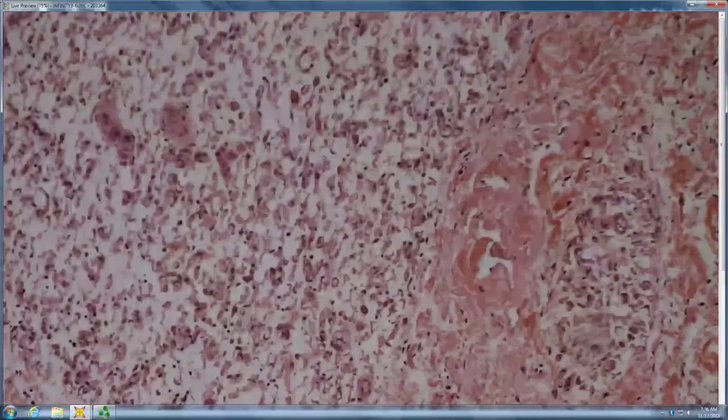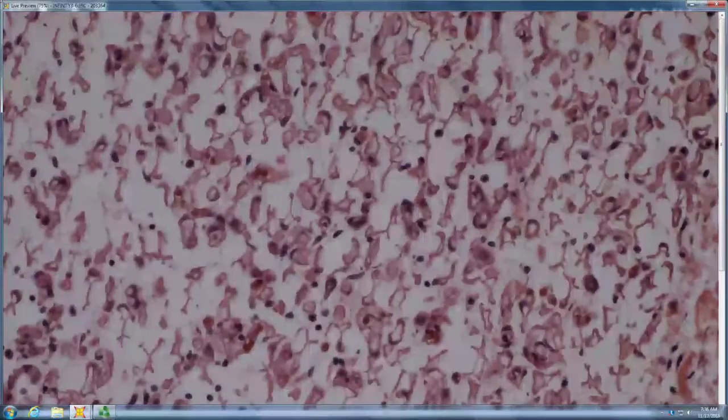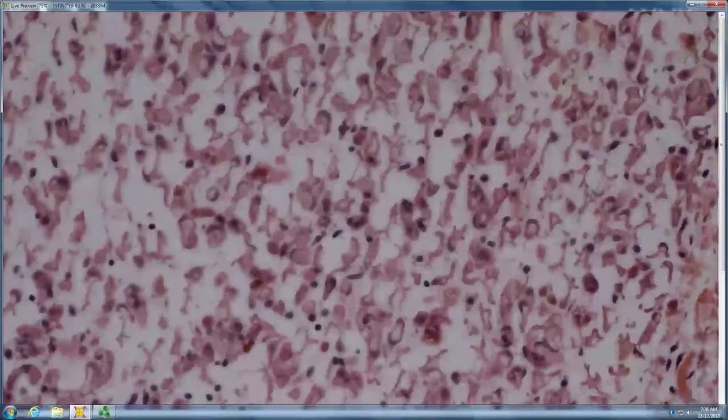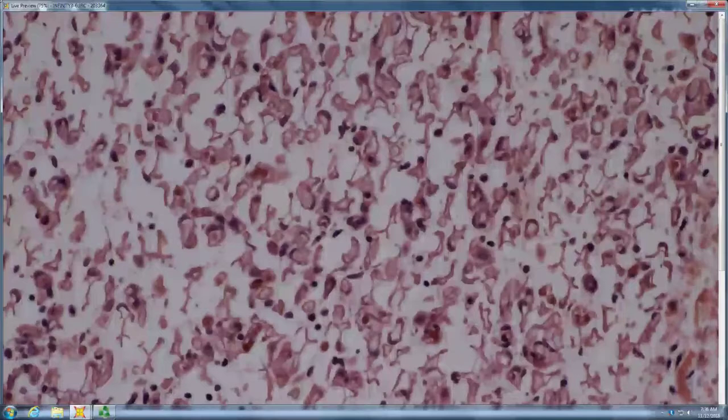It's not very happy, the fats. So what's wrong with it? It's like gone, exactly. So all the fat has been sucked out of the lipocytes. So what's your differential? Fat sucked out of lipocytes, or gone from liposuction?